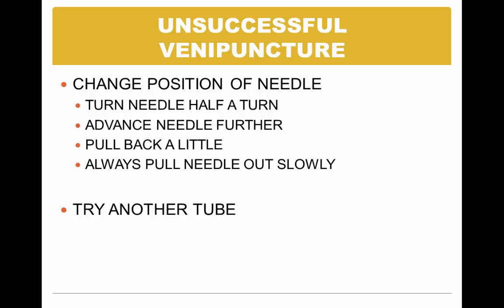Sometimes patients develop hematomas, but you were still successful with that stick, okay? Now when they talk about turning the needle a half a turn, the needle opening may be up against the side of a vein, and so it won't pull the blood through. And again, moving the needle slowly can make a difference between successful and unsuccessful draws, and I explained that to you.